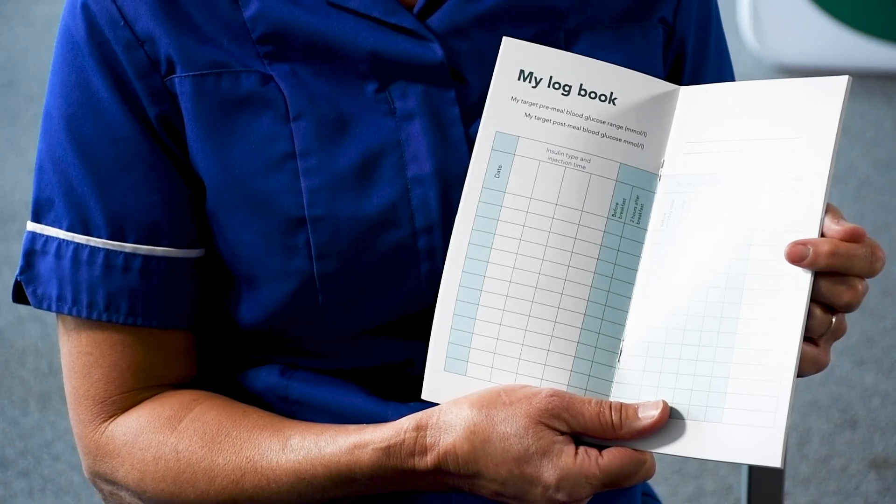You need to keep a record of your blood glucose readings, whether you write the readings down in a blood glucose diary or you use a meter that connects to an app. Please look at your blood glucose readings on a regular basis and try to see where there are patterns or problem areas.